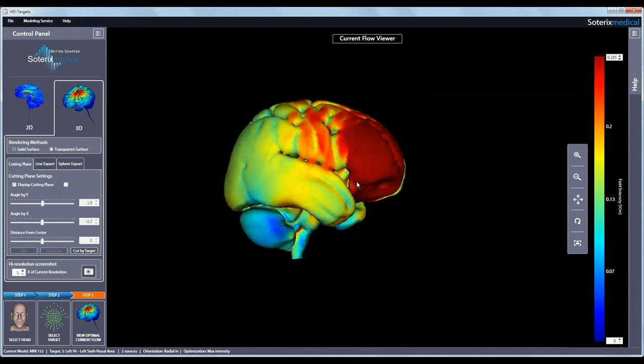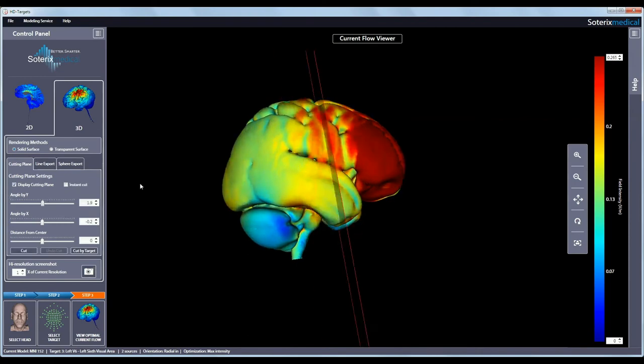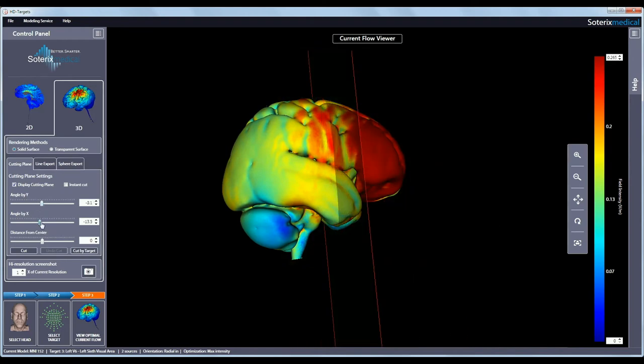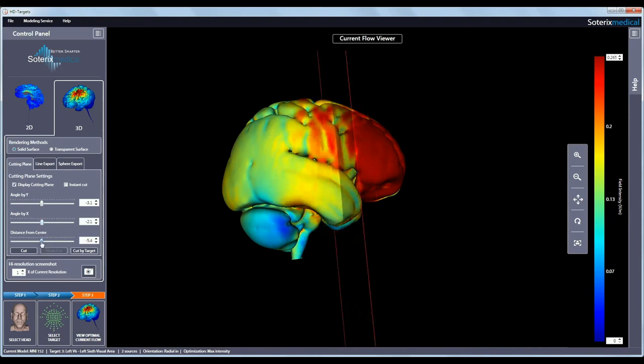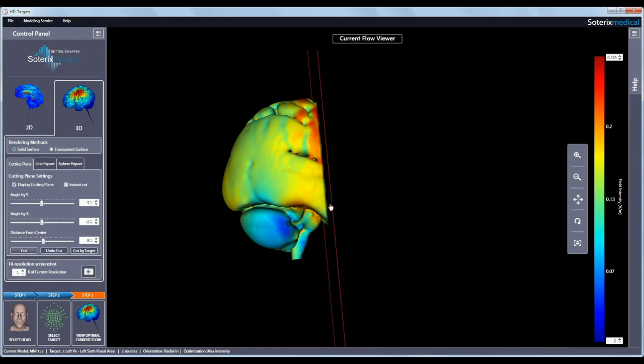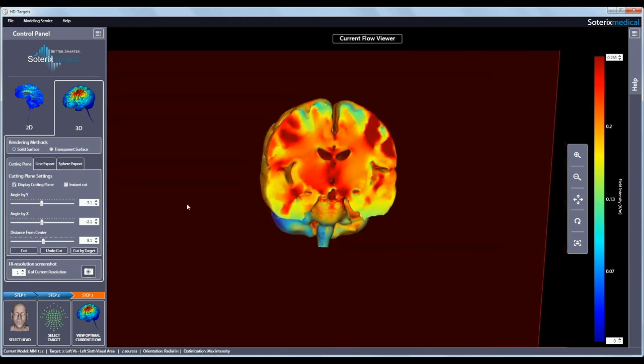By clicking display cutting plane, a plane will be shown in the rendering. The X and Y angles as well as the distance from the center of this plane can be adjusted using the sliders to define a precise location. To cut the 3D volume at the plane and explore current flow inside the head, simply click cut and the head model will be cut at that plane. If you want to undo the cut, just click undo cut.